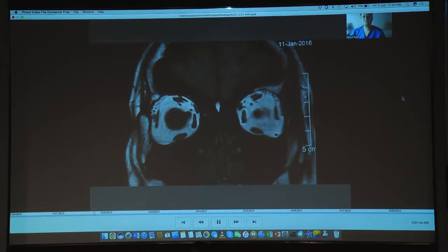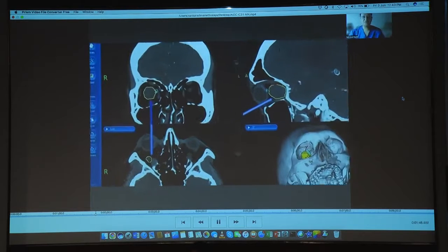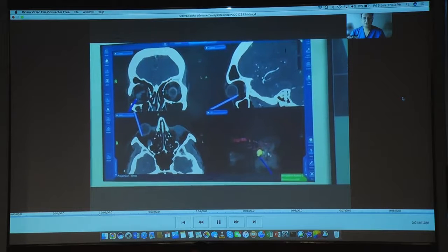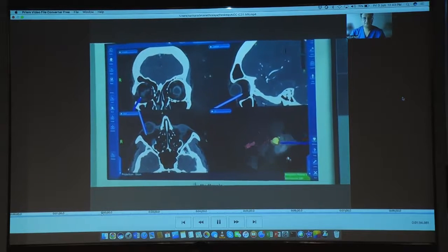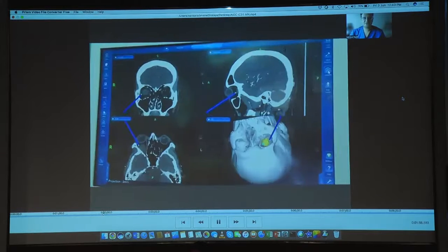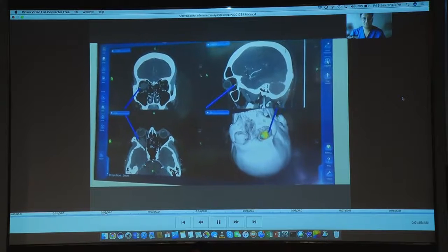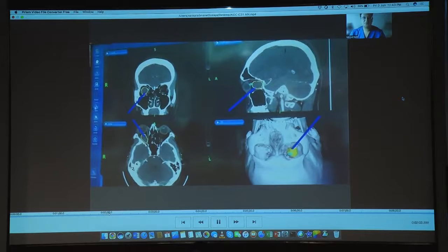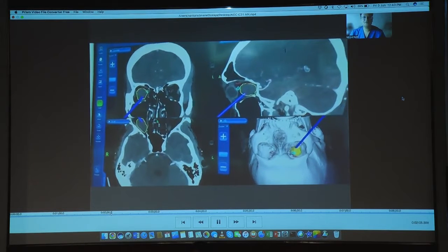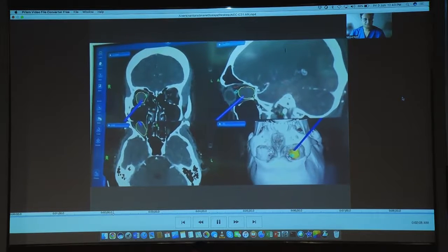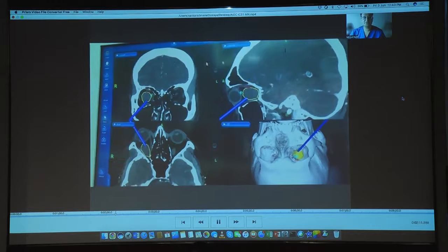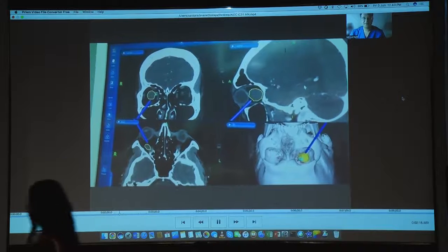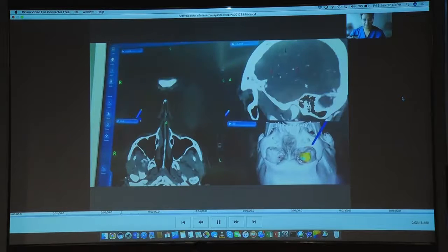We fed the CT angio as well as the MR data into the navigation protocol, which enabled us to evaluate the location of the optic nerve as well as the major vasculature of the orbital apex in real time during surgery. Here you can see the tumor is yellow, the optic nerve blue, and the ophthalmic artery and its branches in red. This enabled us to approach the lesion away from the important structures, thereby preventing the kind of complication we had in our previous case.